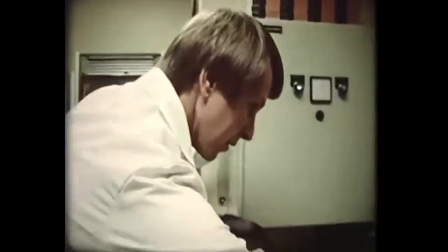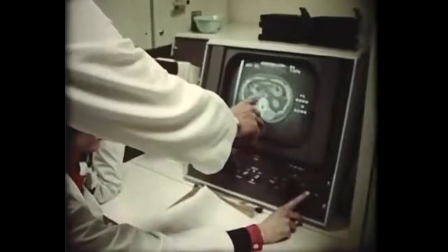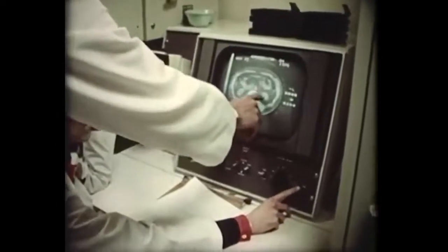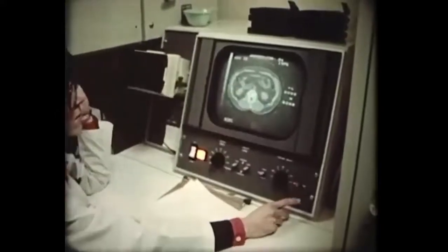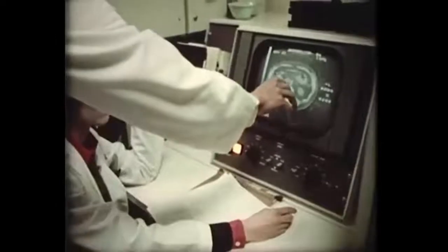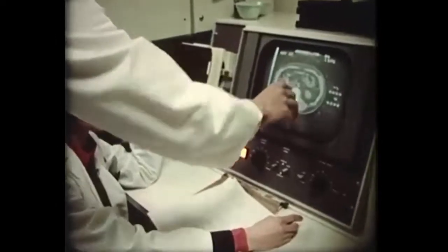The first patient we studied, it was an absolutely perfect study, studies that I still use in talks about how good it was. And we made the decision that it was surgical jaundice, and correctly. Okay, so there we have aorta, cava. CT is steadily replacing the old methods of investigation. Invasive, often uncomfortable, they used to be the only way to look at organs like the pancreas, which aren't accessible to ordinary X-rays. To study the brain could involve undesirable procedures.